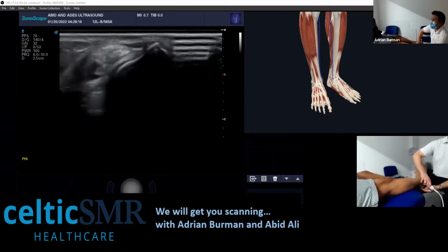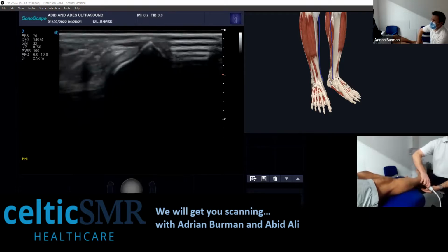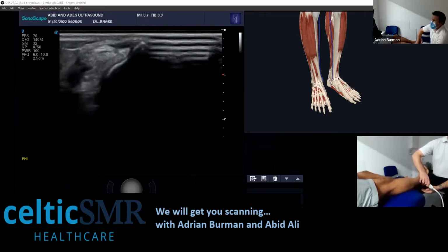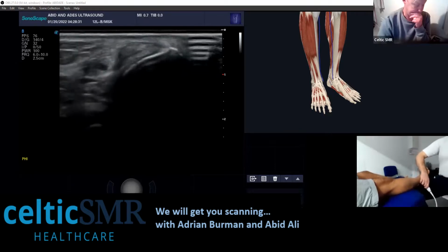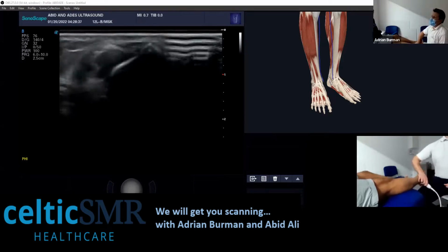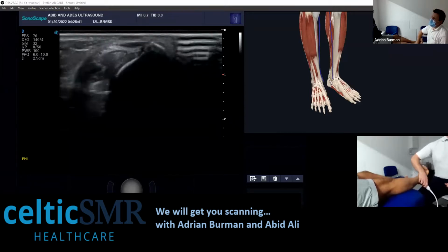It's quite a bony contour as well. So you can see that's not nothing. It just flicks around the brevis, flicks around the longus. It's quite obvious to see. Yeah, that one's not doing it.